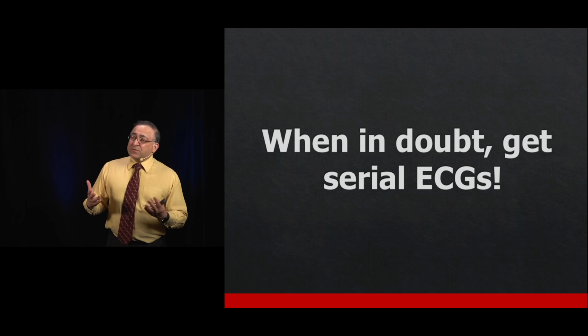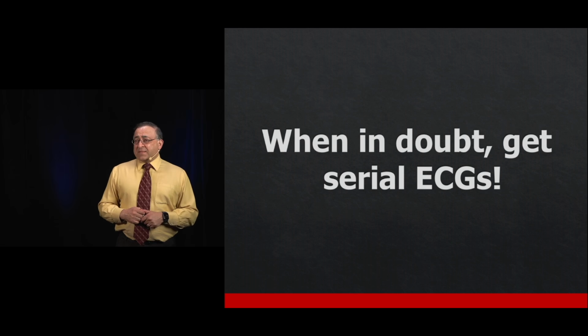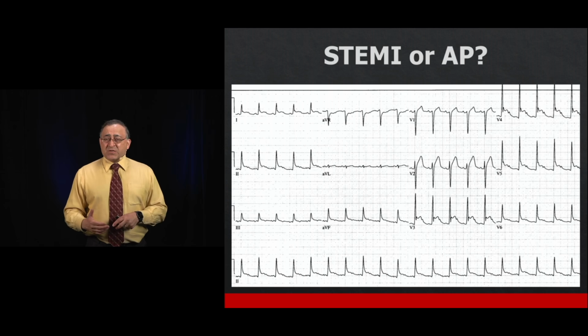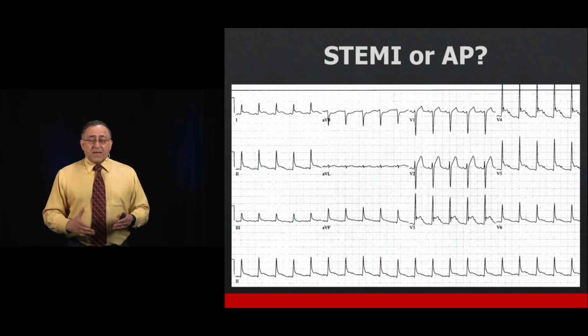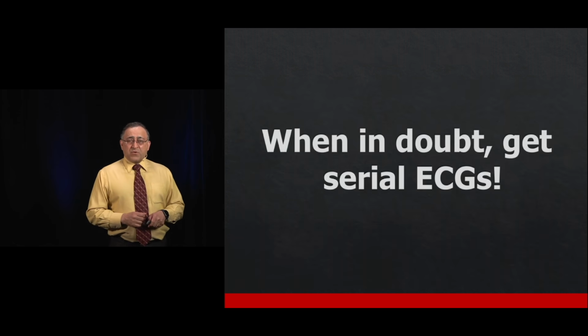Or number three, if you still don't have a good answer, contact cardiology and they might have to cath them to make that distinction. Well, what we did with this case was we just got serial EKGs, and it turned out that nothing evolved. And this patient ended up having just acute pericarditis. So fortunately, ended up doing okay.